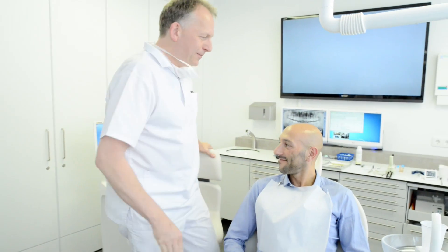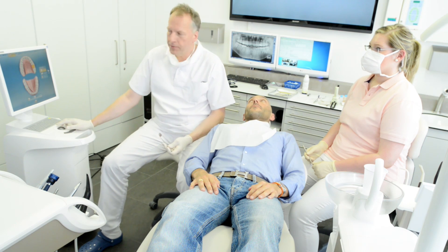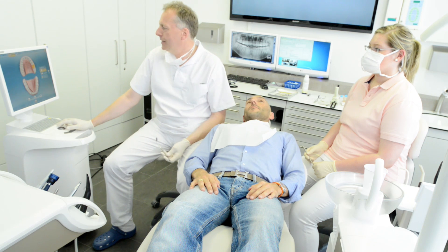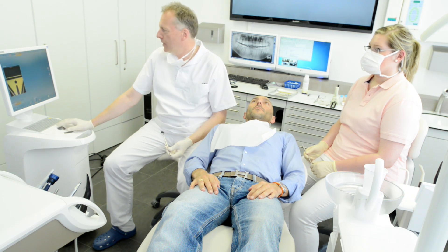Welcome to the Sirona CEREC BlueCam and OmniCam comparative video. This serves to clearly demonstrate the distinctions between the two camera solutions, highlighting their individual strengths and differences. As a simple example, we will compare the two systems in use on a routine onlay case on a molar.